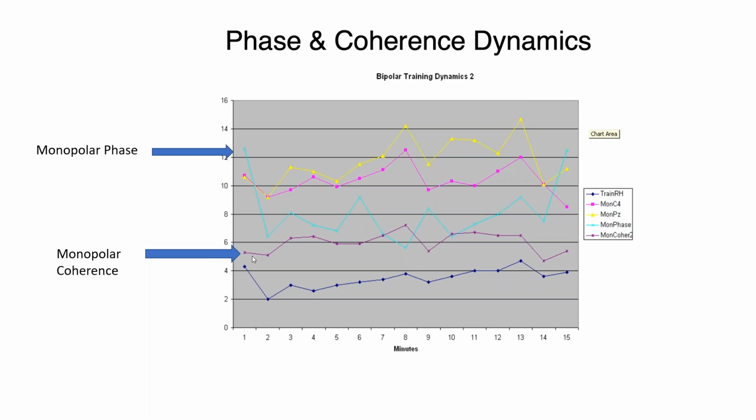Well, in a sense we did because we wanted to see the impact of how the amplifier was interacting with the software and what the outcome was on the screen. And then we wanted to have a single amp on each of the locations. No, I didn't make myself clear. This graph here, you compare the 2 methods of training, right? And you said you checked this out, that's fascinating. I would love to do things like that as well. So my question is, how did you do that technically? I mean, if you have someone with a cap on, that cap has just 1 output. How did you do that then?